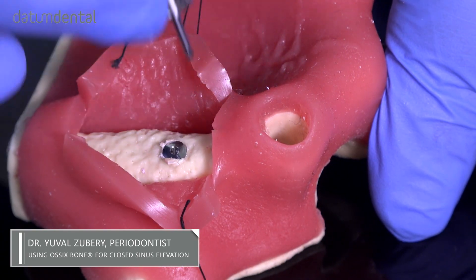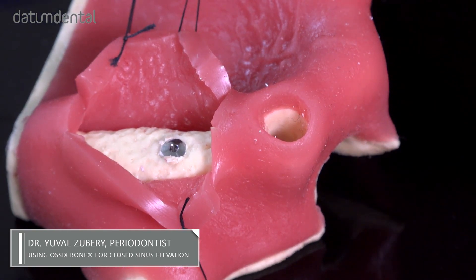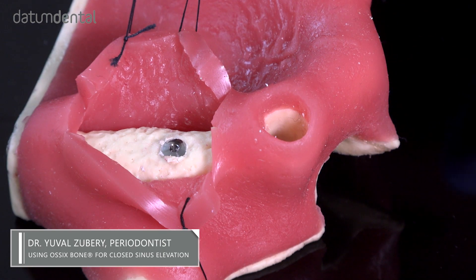The cover screw is placed and the soft tissue may now be sutured.